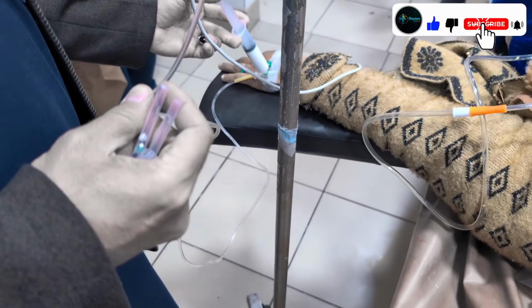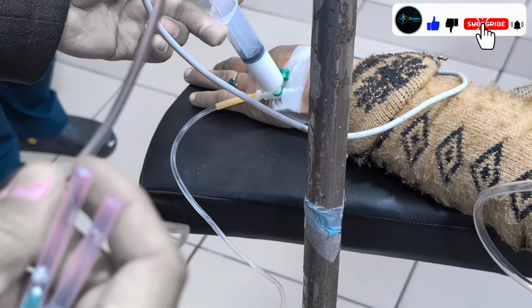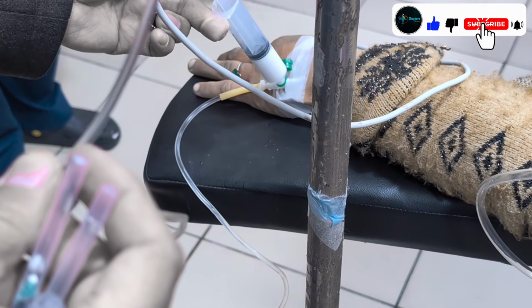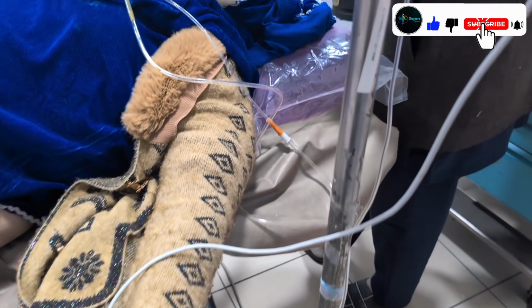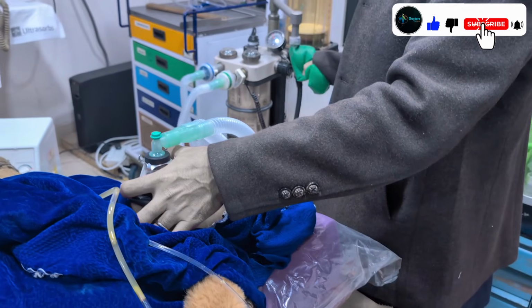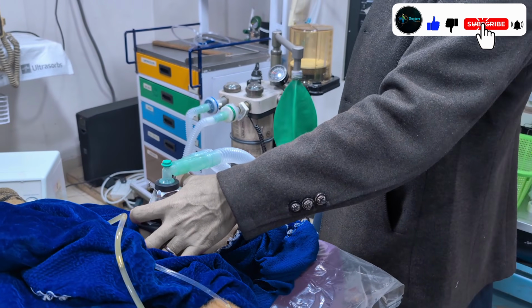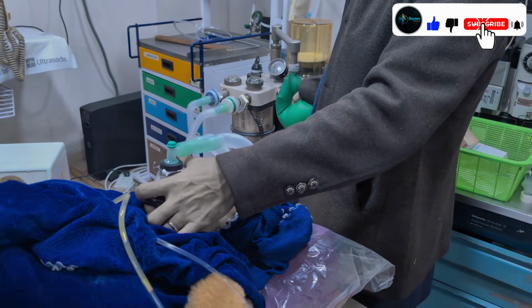Now we are giving propofol to the patient. As you can see on the camera, this is an induction medicine called propofol. We have taken it in a 20 cc syringe. Now we will move to the ventilation side because we have given anesthesia medicine to the patient. We will now ventilate the patient.